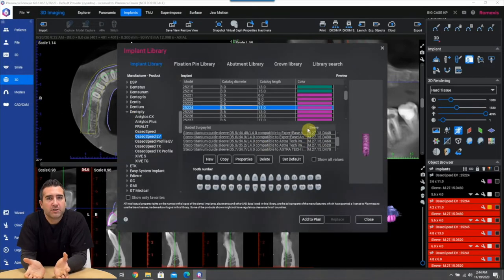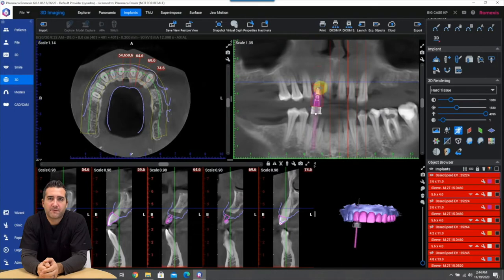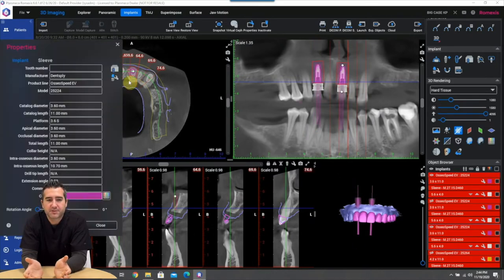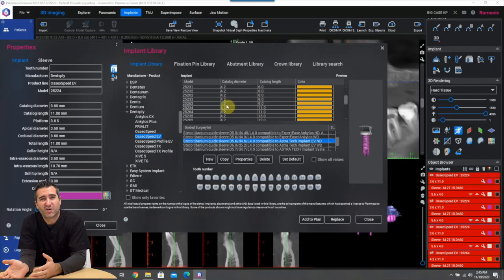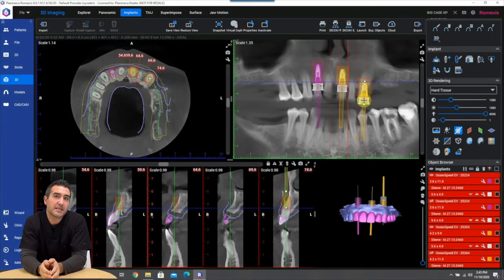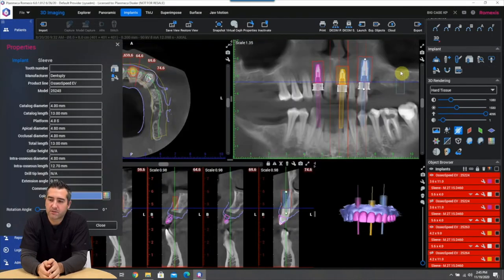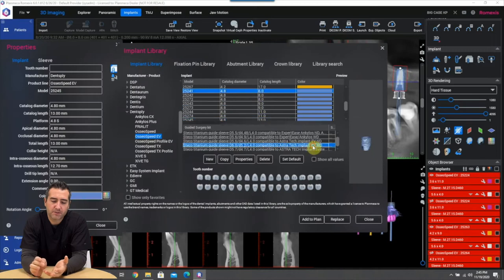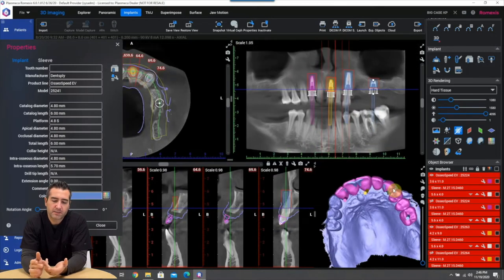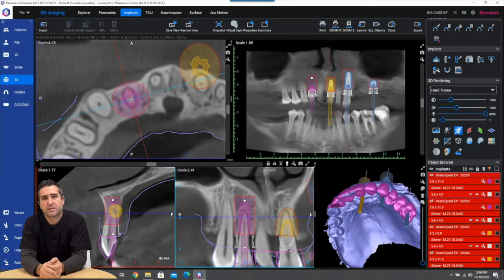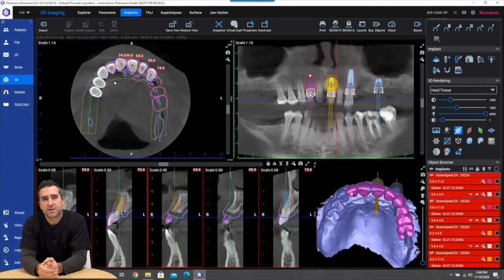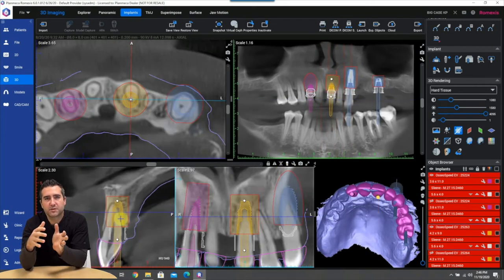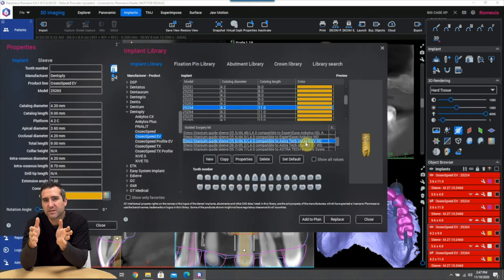There's like a gajillion implants you can pick from, all your favorite manufacturers are in there. Some implant manufacturers have partnered with PlanCAD to put all their specs in there so you don't have to do any mathematics as it relates to sleeve height. So like for example Straumann, Camlog, Bio Horizons, Urus which is one of my faves, everything's predetermined so you don't have to do anything.